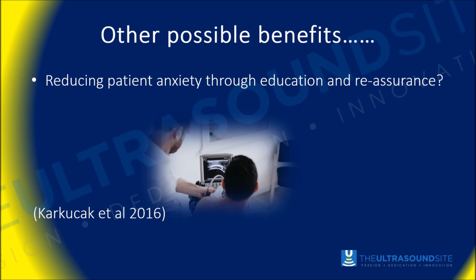Some of these other benefits don't get picked up so often on some of these rather binary studies about whether it improves treatment outcomes, but it's all about the patient experience, patient journey, and how they evaluate the treatment that they've received and the way it was performed.